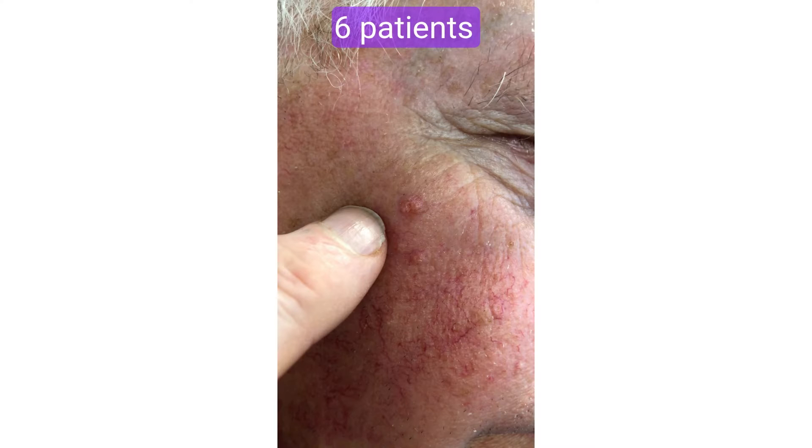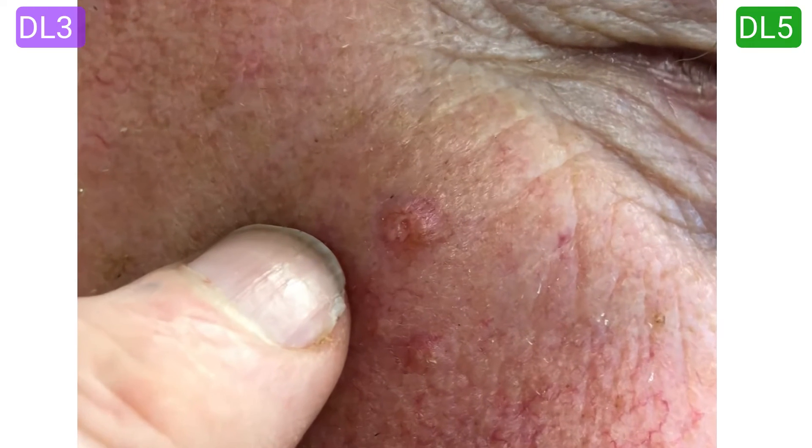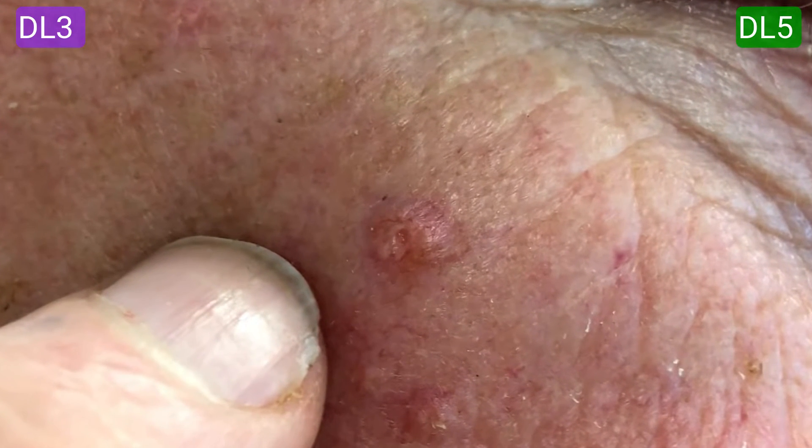The other way to compare the DL5 and DL3 is on my patients. Here are six patients of mine comparing the DL3 and the DL5 images. I'll keep quiet so you can concentrate — can you make a diagnosis on each?